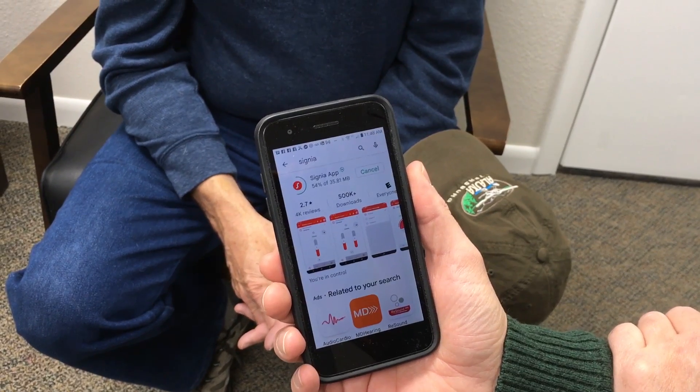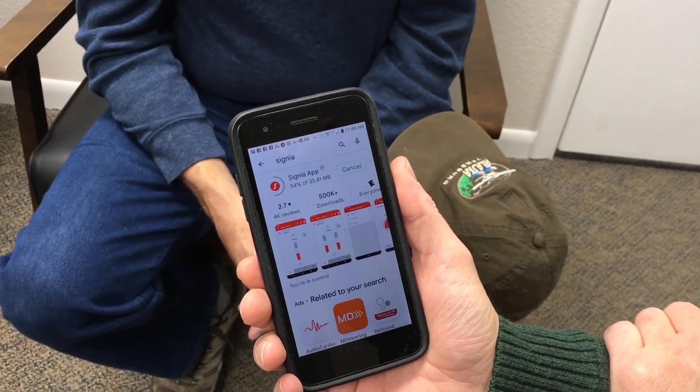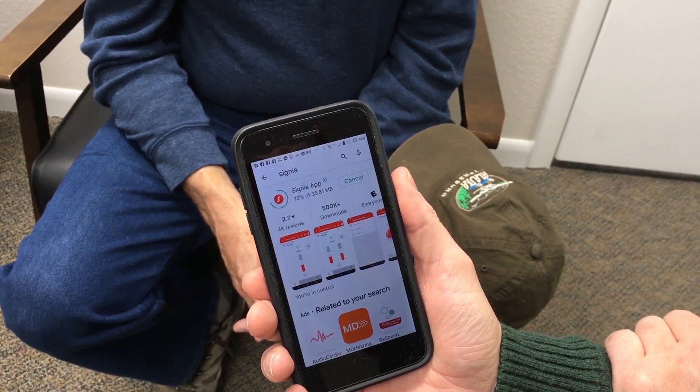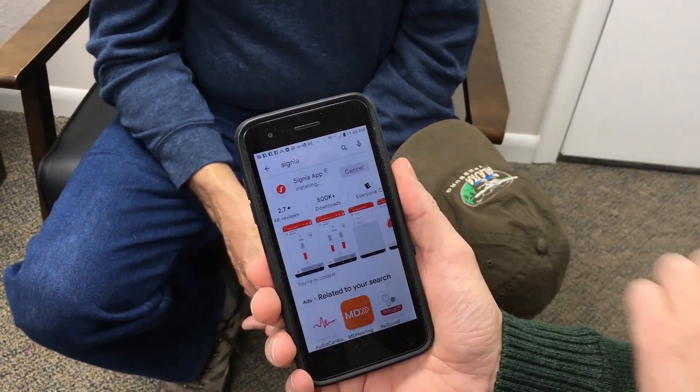It's going real fast, which is nice. I would recommend plugging into Wi-Fi for this so you're using internet and not cellular data — it'll go faster. You can see there it's installing, so we'll just give it a second.